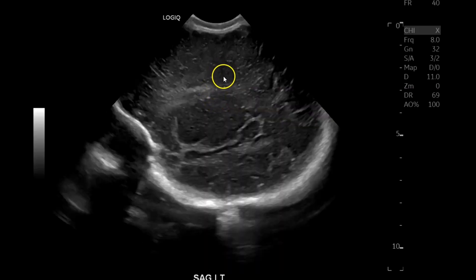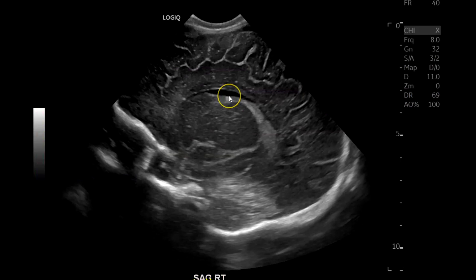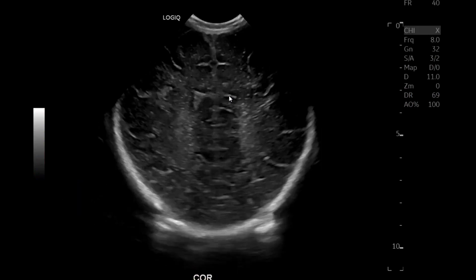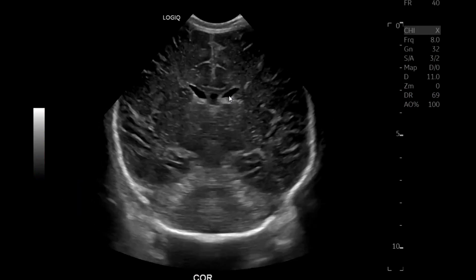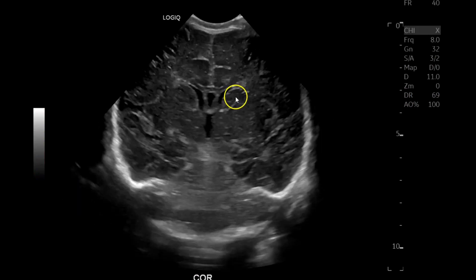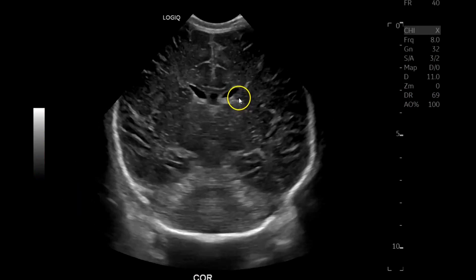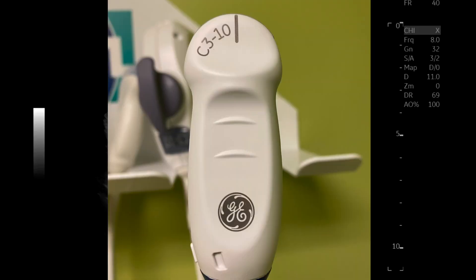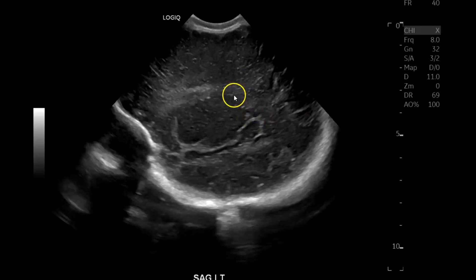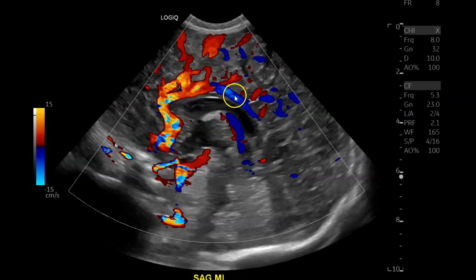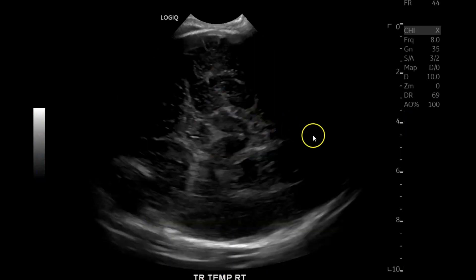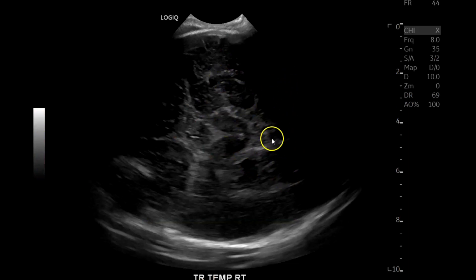Then the same thing on the left — caudal thalamic groove, check for bleeds in this area, then lateral. You can see these images are very similar to what you would get with the Logic 9. This is with the C310, the little micro-convex array probe that is just fantastic for these studies. Then we do color Doppler.